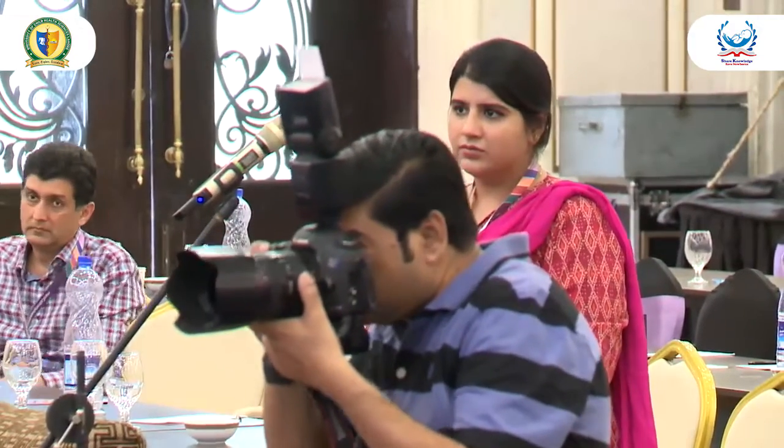Assalamu alaikum. I'm from Liaquat National Hospital, Karachi. In our NICU, the PICC lines get blocked very easily. So how to prevent that? They get blocked easily if you don't have trained staff. If the staff is not trained how to use it and how to prevent clogging, it will clog. So you have to run the fluid continuously, 1 ml per hour minimum. In some books, it is written 0.5 ml per hour. If you are giving TPN or any other fluid, it must run continuously.